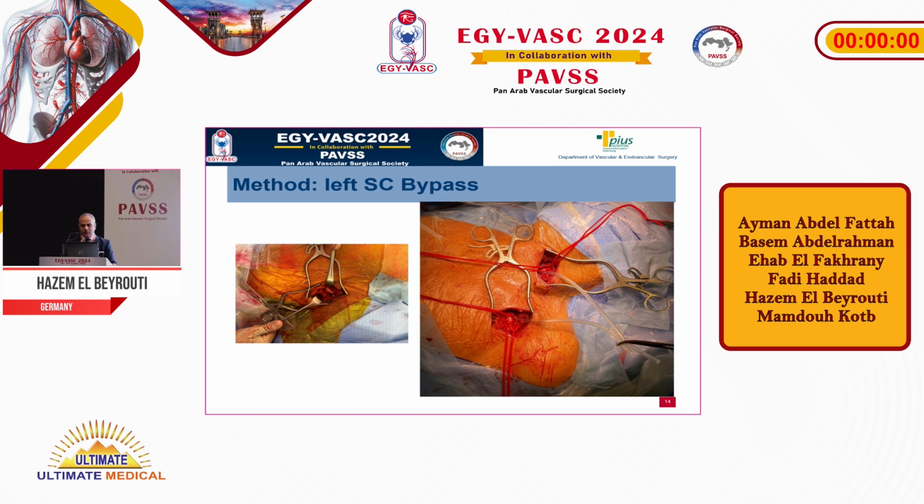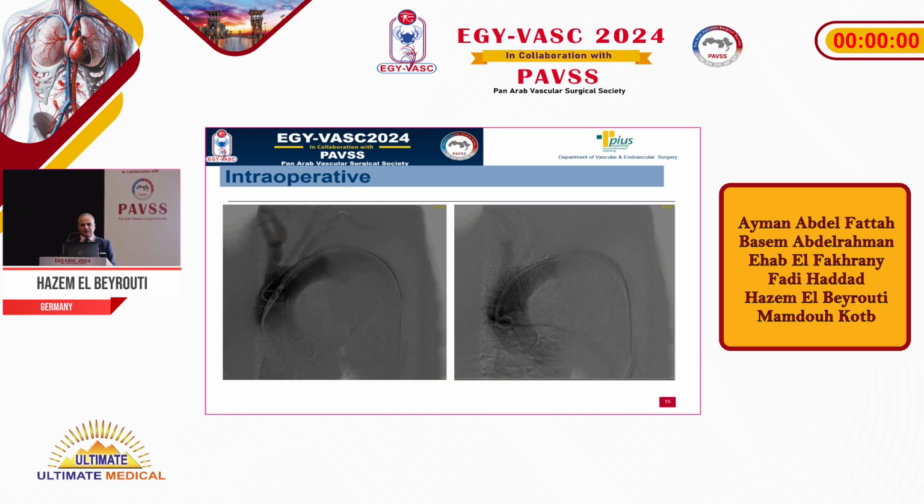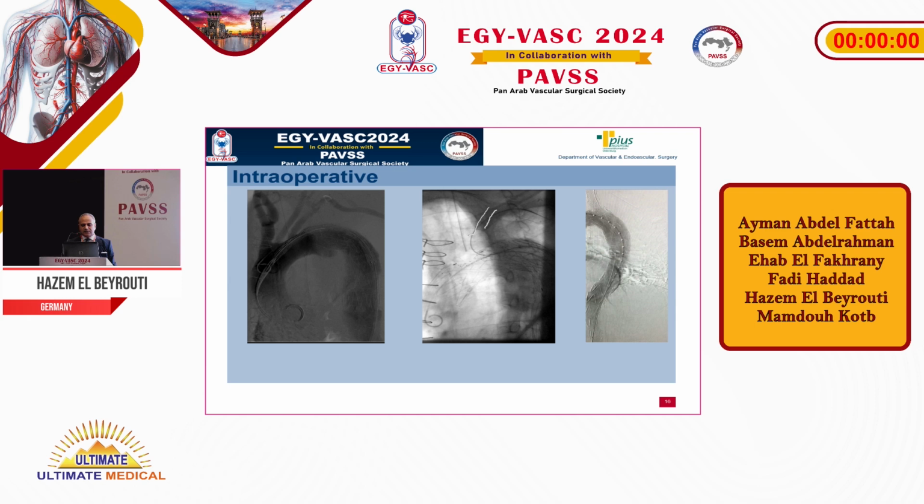As you can see here, with an 8 millimeter Dacron prosthesis, we performed these bypasses infraclavicularly, as we wanted to avoid the mammary zone, considered a sacred zone. After the bypass, simultaneously, we performed the deployment of the TEVAR in zone 1, covering the left subclavian artery and the left common carotid artery. Subsequently, we implanted a VBX from Gore, 10 millimeters wide and 59 millimeters long, in the subclavian artery through the retrograde single branch. And the entire operation was performed via a percutaneous puncture approach.